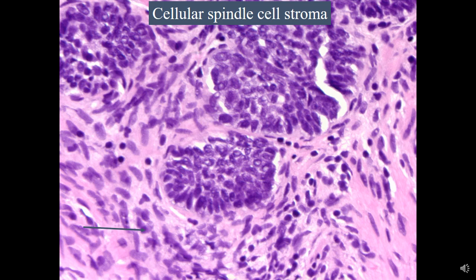When a lesion shows a reactive type of cellular spindly stroma proliferation, as in this example, it usually points towards a proliferative or benign lesion. This is typically the stroma you encounter in nodules of benign prostatic hyperplasia. Three histological variations — basal cell hyperplasia, adenosis, and sclerosing adenosis — classically present with this type of cellular spindly stroma. Also importantly, this is not stromogenic prostate cancer or desmoplastic stroma. Stromogenic prostate cancer has a typically very edematous, whitish, and inflammatory stromal appearance, which you should not confuse with this cellular spindly stroma.